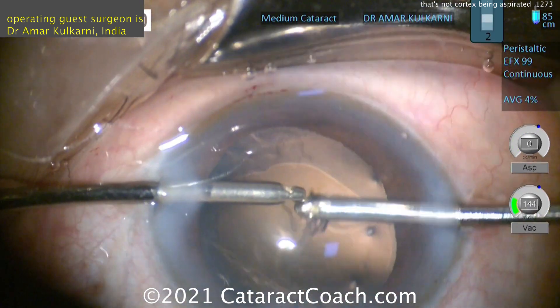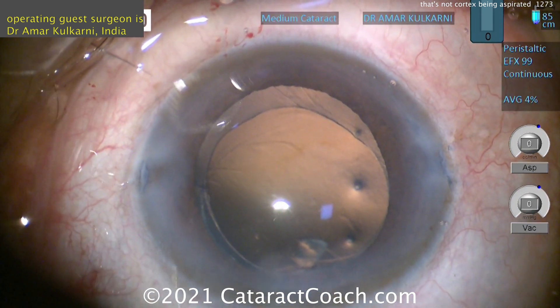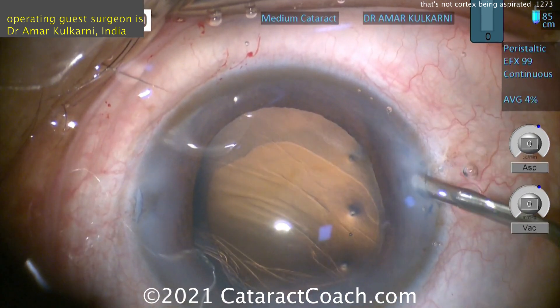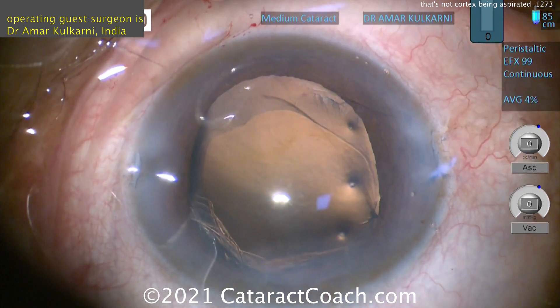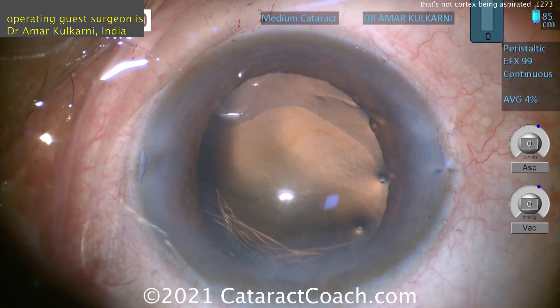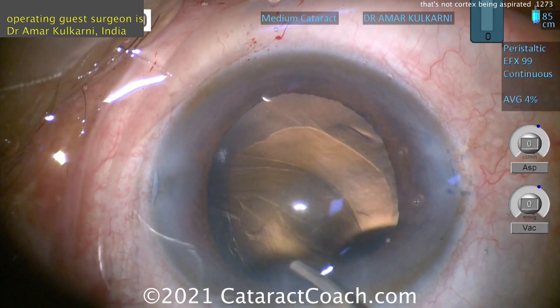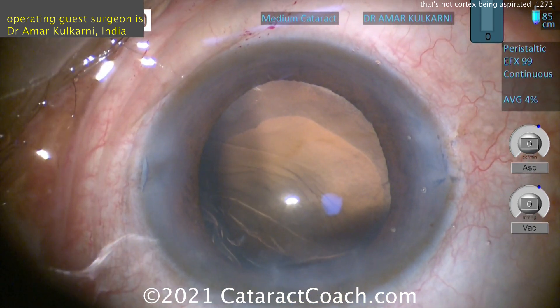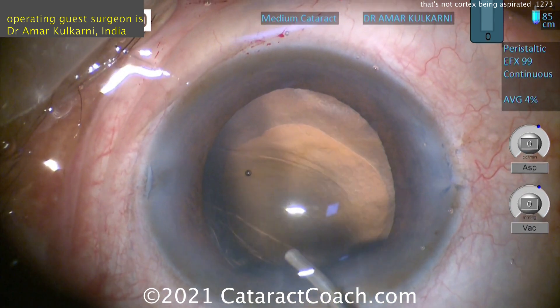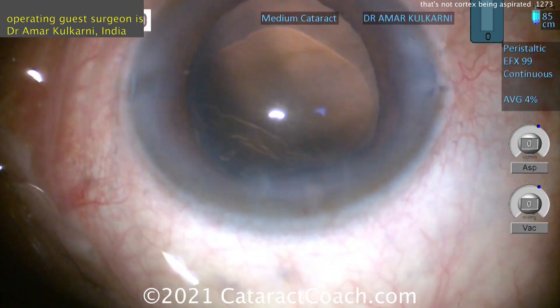Come out with the aspirator but leave the infusion in — don't take them both out. Then put viscoelastic in. Definitely needs a capsule tension ring. Fortunately, I think this is only a few clock hours of zonular dehiscence — maybe three, maybe four clock hours. A CTR alone should be sufficient. Once you get to six clock hours or so, you may have to use a sutured CTR, capsule tension segment, or some other technique. But in this case, we should be able to put the CTR in without too much issue.